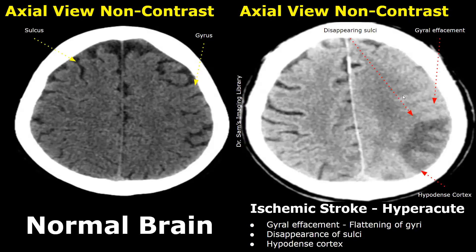We can see these folds are straight. Also, we will notice disappearance of sulci — we do not see these grooves between the gyri. This is due to increasing swelling of the brain tissue at the affected site. We will also find hypodense cortex at the site of infarction.